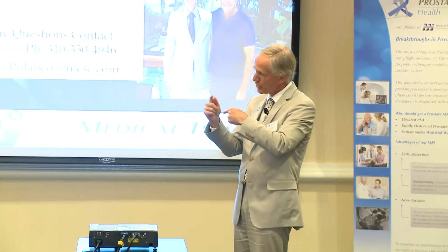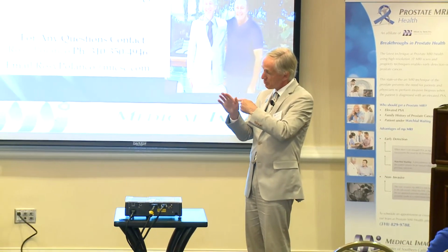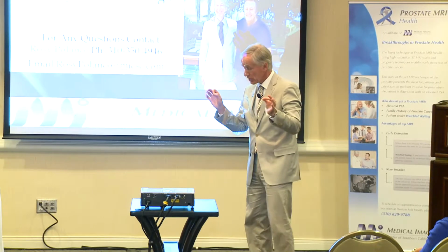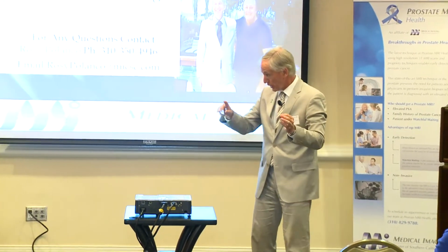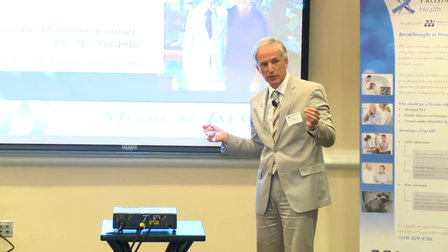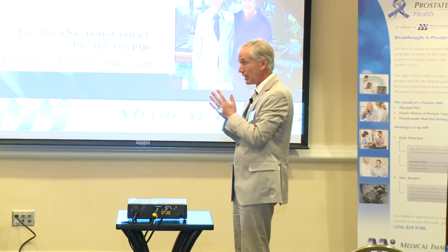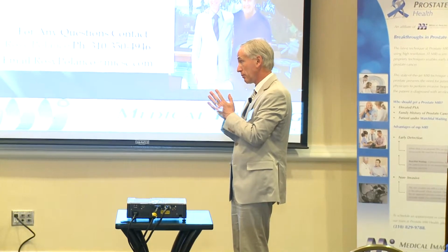If you have a probe having a pressure which is independent of the urologist, so a vibrator or something like that, it would be good. Histoscan has been proven to be not as accurate as MRI, period.